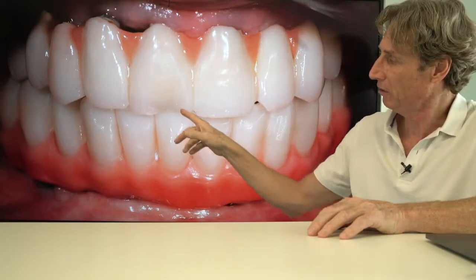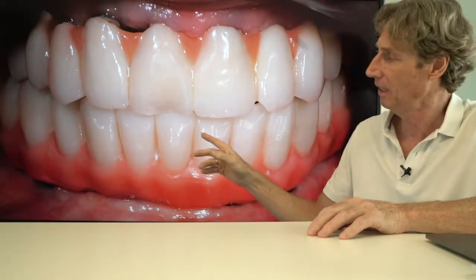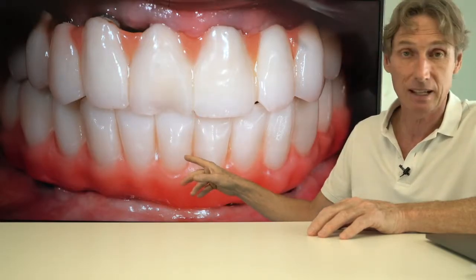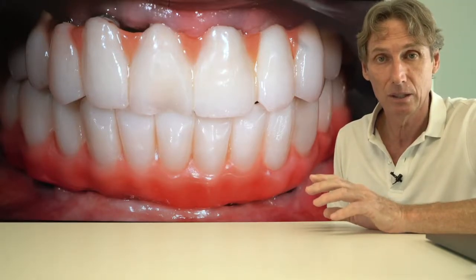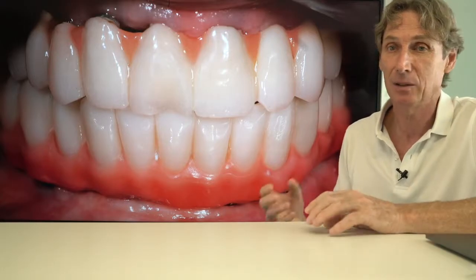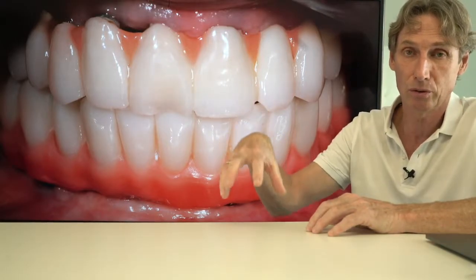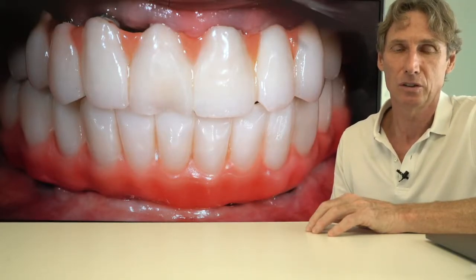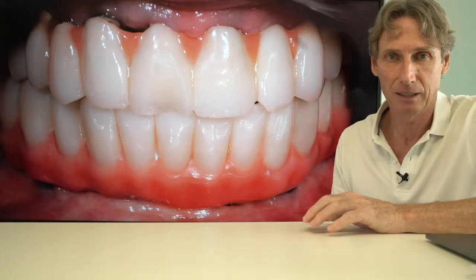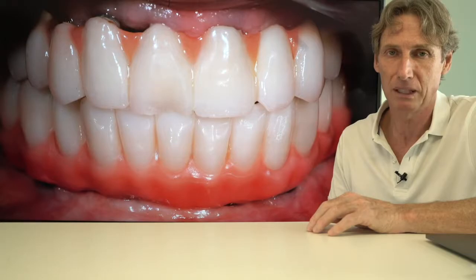And so if this should happen for some reason or for an accident in the SIEWERT bridge, it's absolutely easy to take a crown out. It's cemented like we are used to cementing a crown on a natural tooth. We can mill a new zirconia crown and cement it, even without retrieving the bridge out of the patient's mouth.